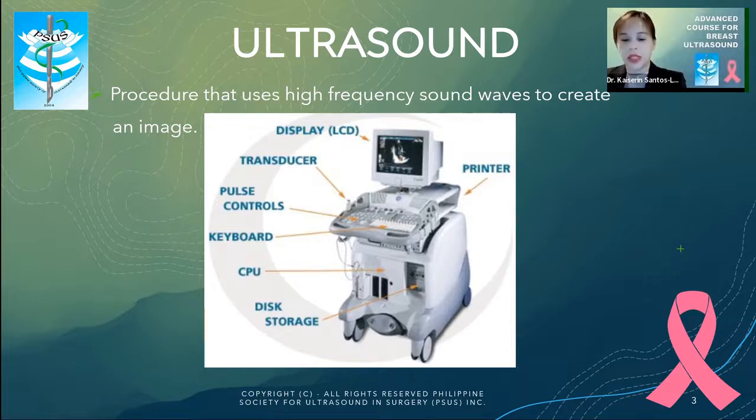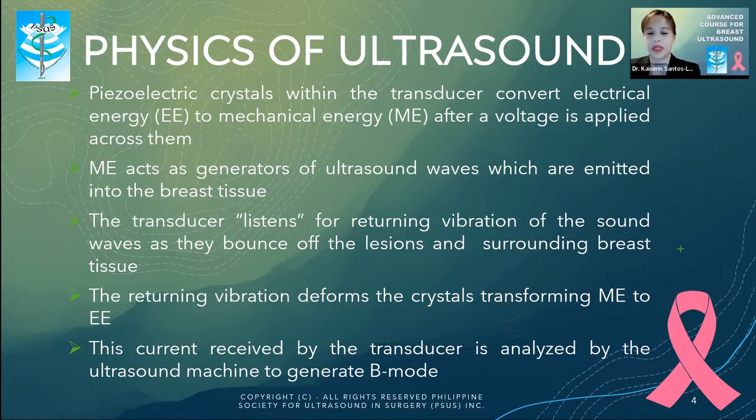The ultrasound uses high-frequency sound waves to create an image. This is a summary of the physics of sound. Transducer is the key. Piezoelectric crystals within the transducer convert electrical energy to mechanical energy after a voltage is applied across them.